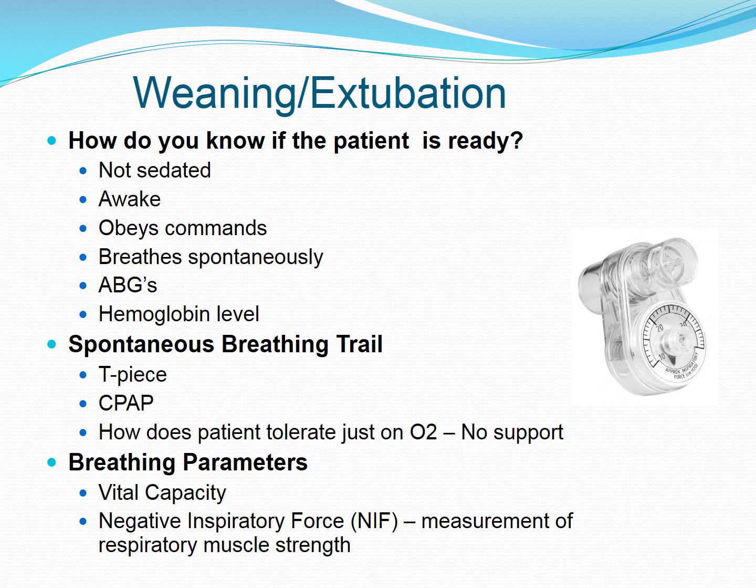The other thing that they do is something called negative inspiratory force, or NIF. The picture on the slide is the little piece of equipment that they use to measure NIF. We tell the patient to take a deep breath and hold it as long as you can, and then we look at this little piece of equipment. If it's greater than a negative 25, then you're able to extubate.